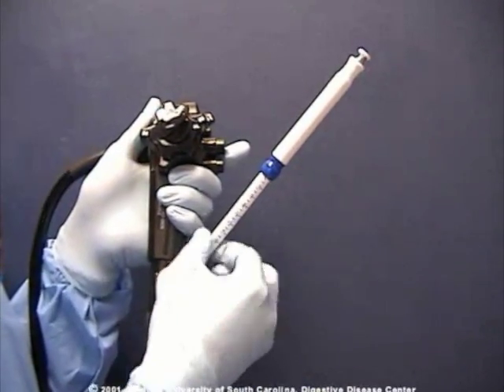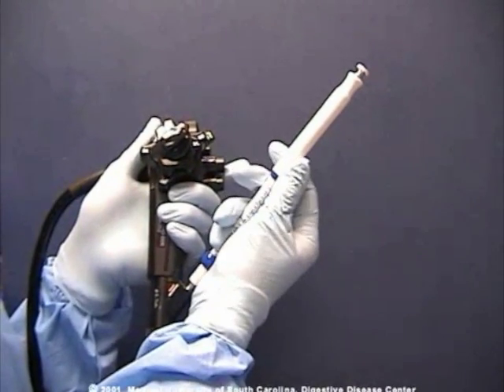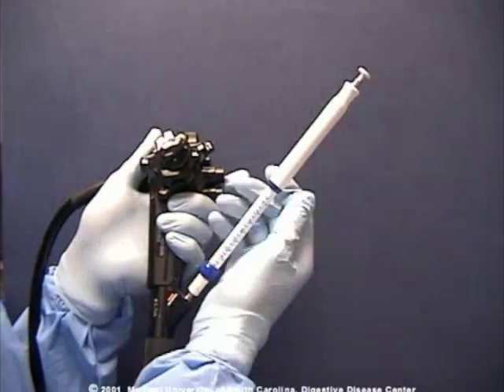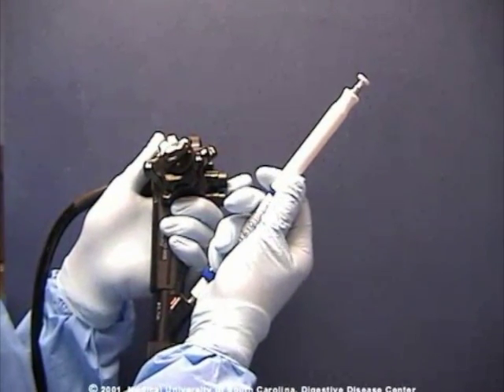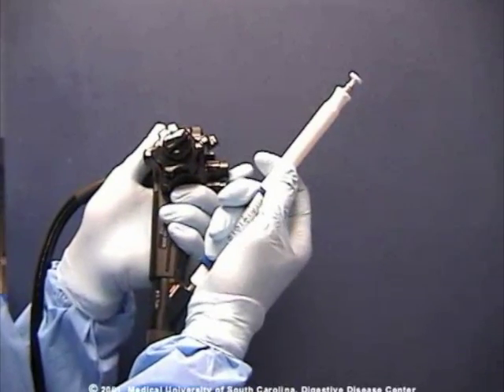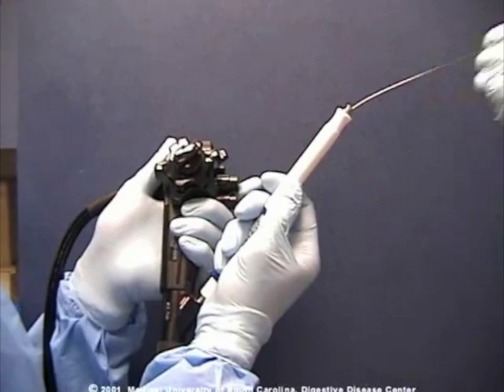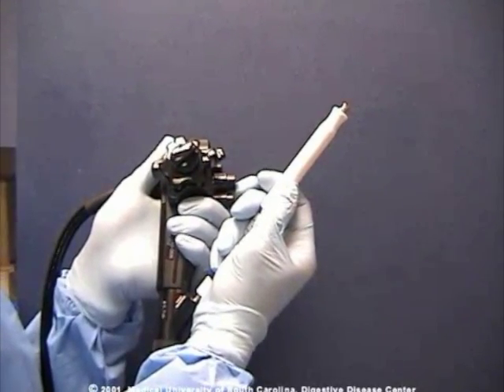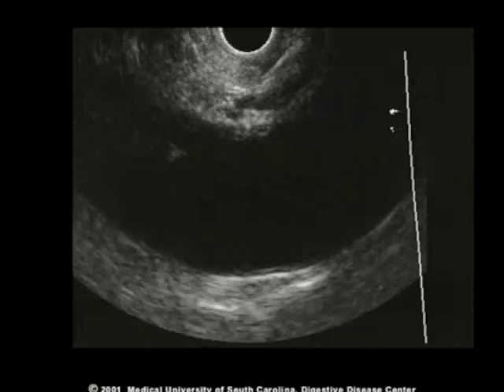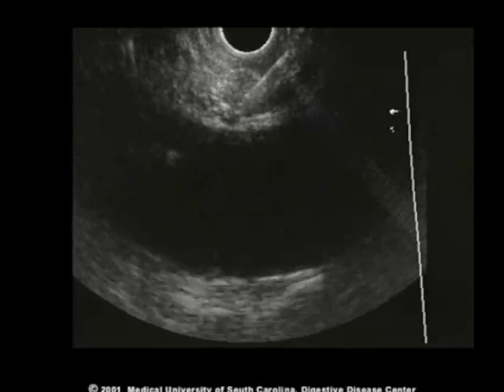The needle is attached to the echo endoscope. The stylet is withdrawn slightly and the needle is punctured into the space immediately anterior and cephalad of the celiac artery takeoff. This is shown here.